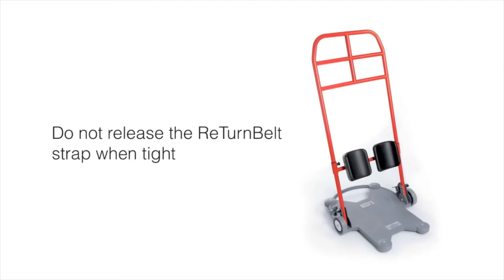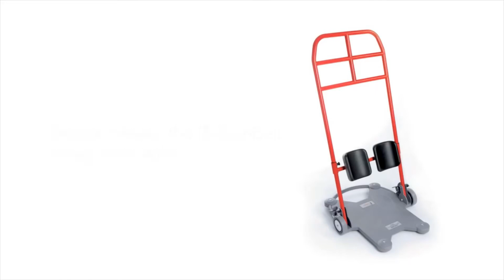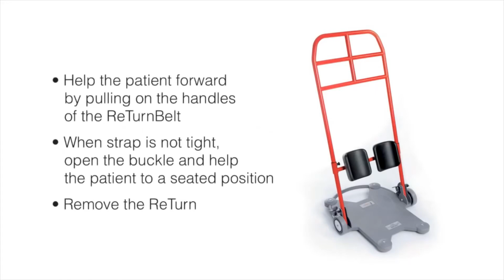Before sitting the patient down, release the safety strap. Do not do this when the strap is tight, as the patient could fall backwards. Always start by helping the patient forward by pulling in on the handles of the Return belt. When the strap is not tight, open the buckle and slowly help the patient to a seated position.